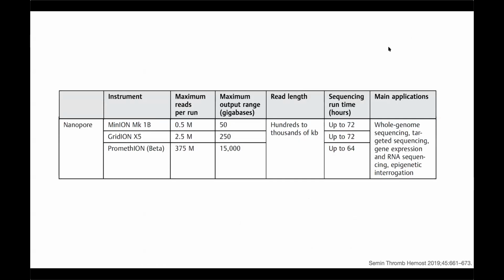And here's the other instrument, and I chose these two fairly carefully because Illumina and Nanopore are the 2 instruments that are most frequently used for sequencing SARS-CoV-2, and they're sort of on the other ends of the spectrum. So Nanopore is a much smaller player. They sort of target a different end of the market.